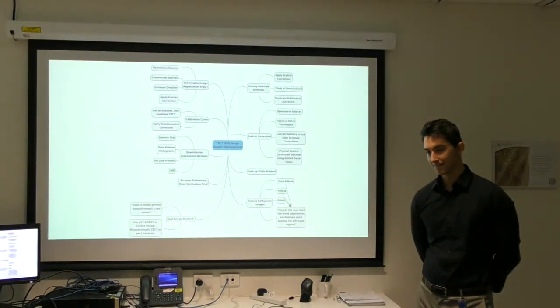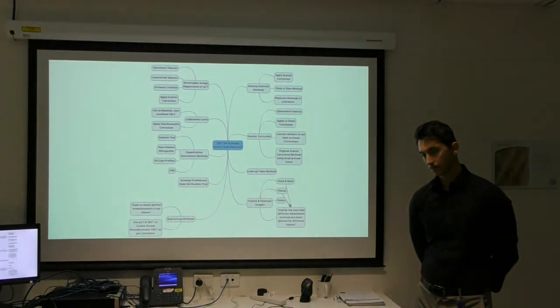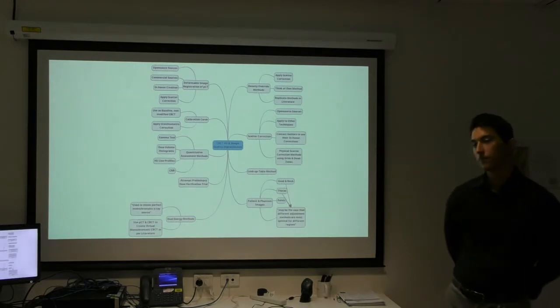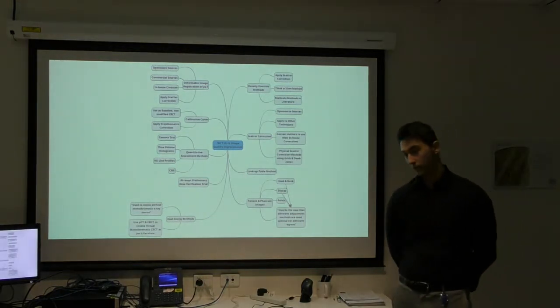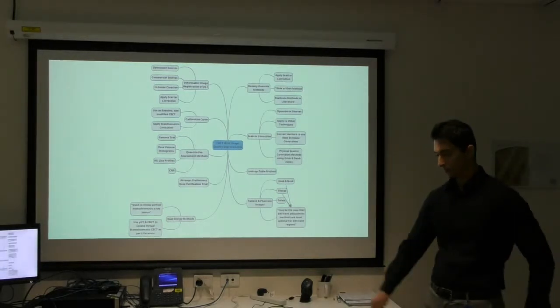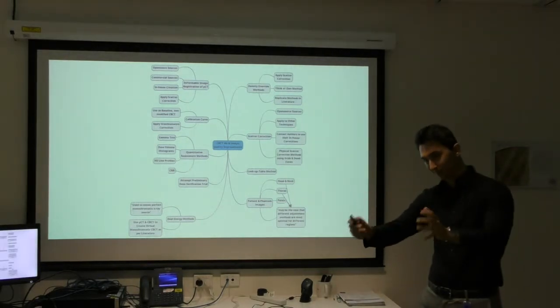This is great. So you talked about motion artifact. So if we're doing a CBCT on a linac, why would motion be a particular problem? So motion can be voluntary or involuntary, and I guess you can always use certain straps, I don't want to say straps, but you can hold the patient.